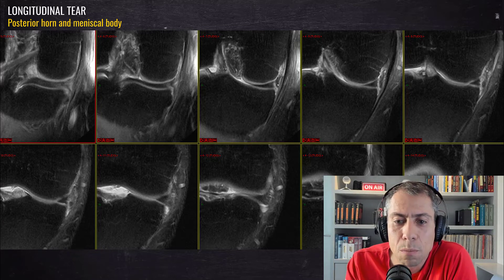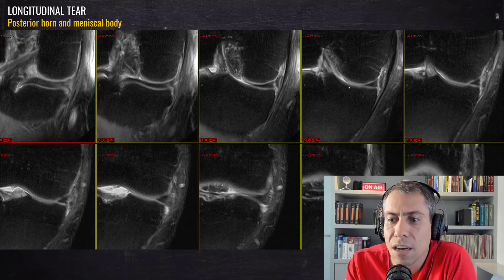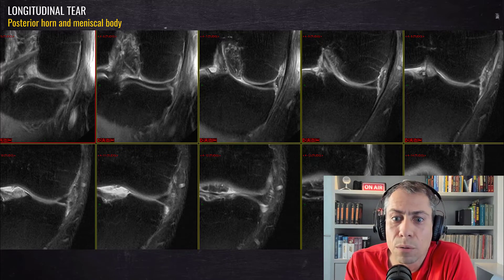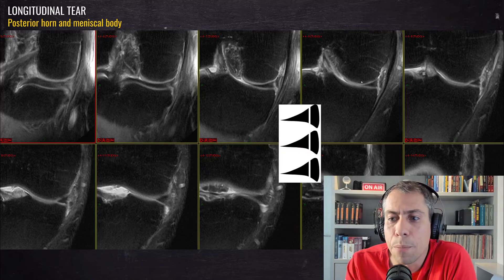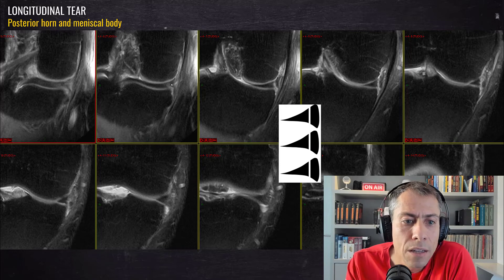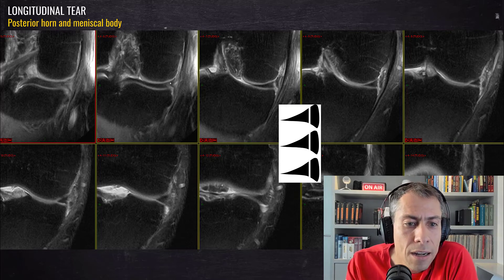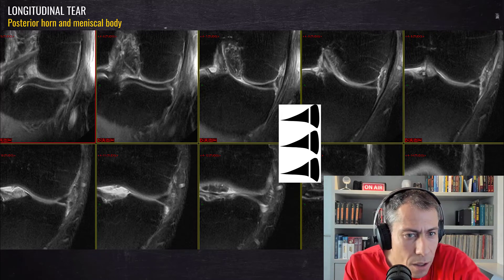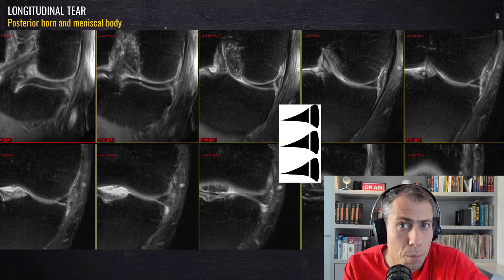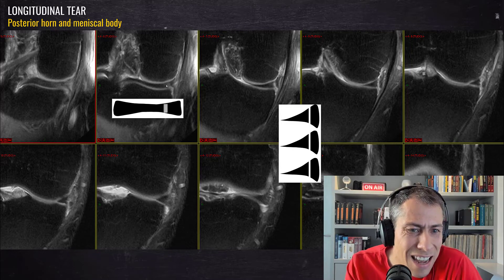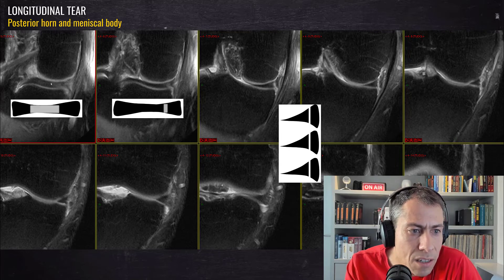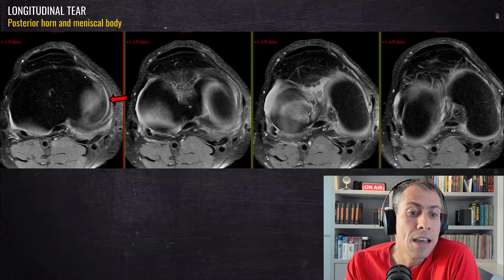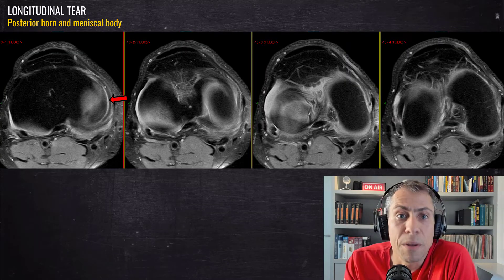That's the pattern at the meniscal body. Now here in the posterior horn, the cuts pass almost at the same plane as the tear, so the meniscus becomes blurred in this area — another spectacular illustration of that blurring effect.